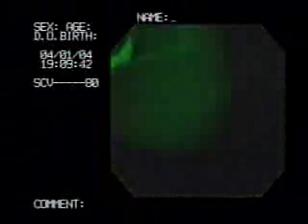The right main stem bronchus is re-entered, and the right upper lobe bronchus is now washed in order to obtain cells.